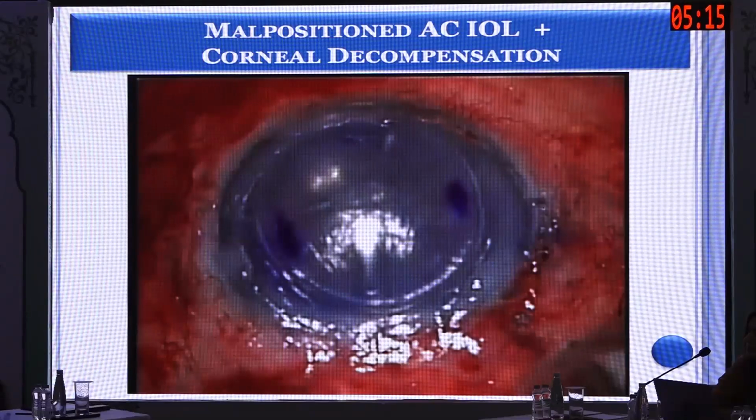But when you are doing Yamane, it creates a problem. So I'm using some PVDF haptic lens. There is another Indian company also that is making IOLs with PVDF haptics. So with the Yamane technique, if you use a PVDF haptic IOL, then it works very well. With PMMA haptics in Yamane, it doesn't form a nice flange also.